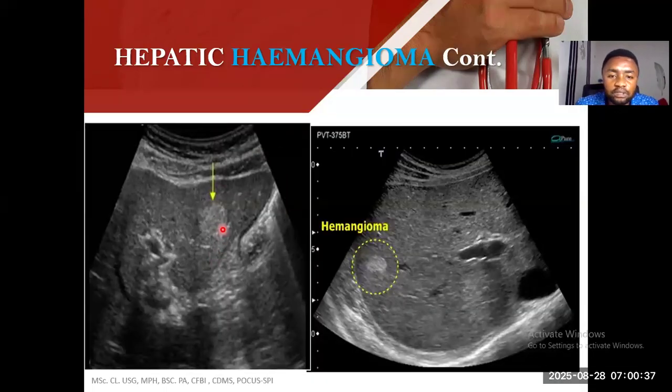So have you seen it? The hemangioma is here, very nice. Where my cursor is, hemangioma, very nice. And have you seen that this image has captured the full liver? So this is a full liver over there. But this liver, I don't know, it may not be an adult liver or it may also be an aged liver. You understand?